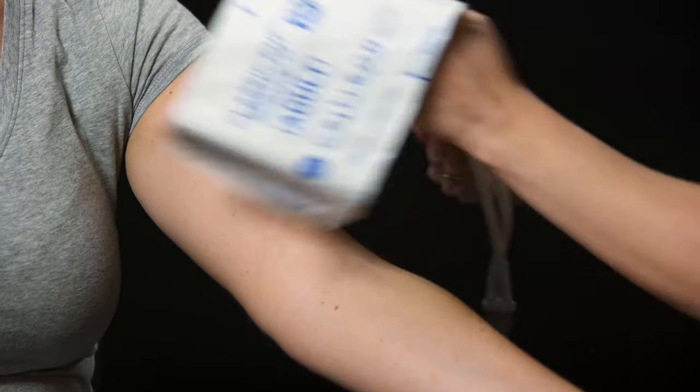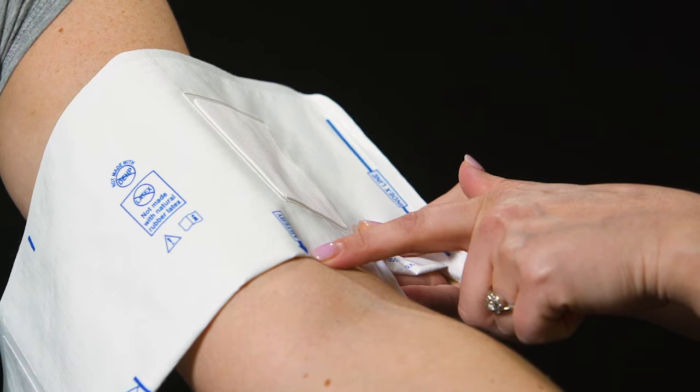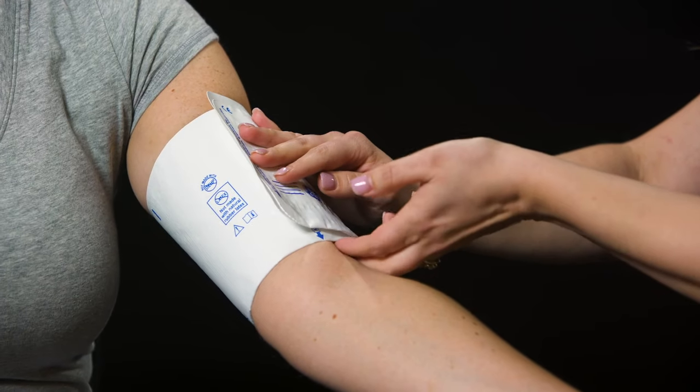When placing the cuff, the artery indicator should be placed over the patient's brachial artery. Wrap the cuff firmly around the patient's upper arm, allowing for two fingers between the patient and the cuff.